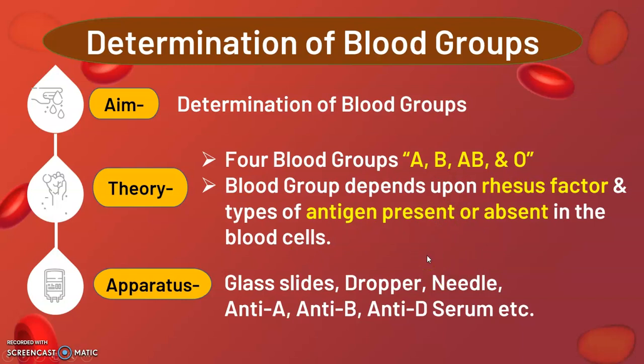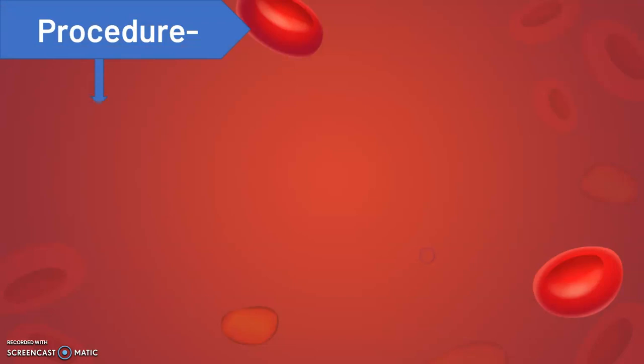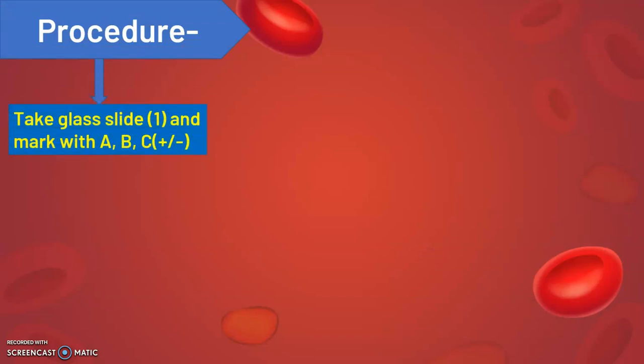With the help of these we will find out our blood group. Now, the procedure: first, clean the glass slide with a napkin and mark it with a sketch pen or marker with points A, B, and C — capital A, capital B, and capital C — leaving some space between the two letters. C stands for determining whether the blood group is positive or negative.